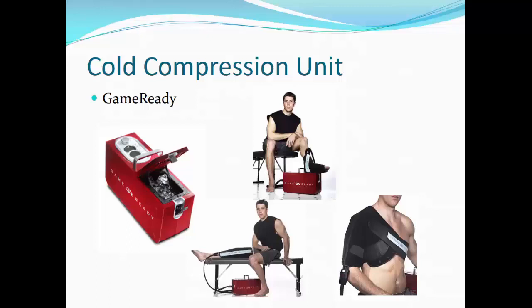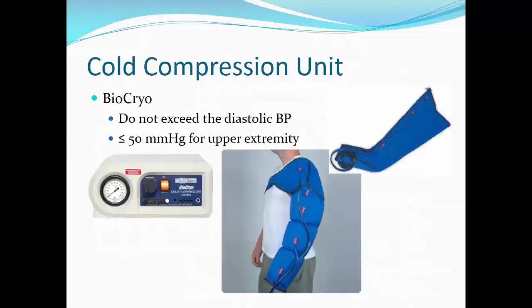duration of the treatment. The BioCryo is a little bit older form of a cold compression unit. This unit requires that the extremity devices be kept in a freezer. A stockinette or a barrier must be provided in between the skin and the extremity device when applied to a patient.